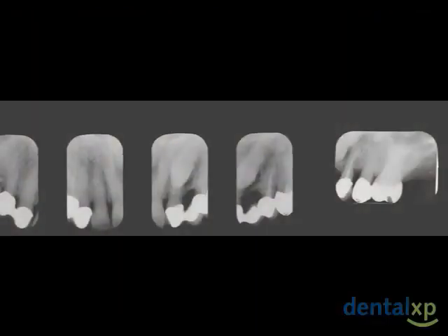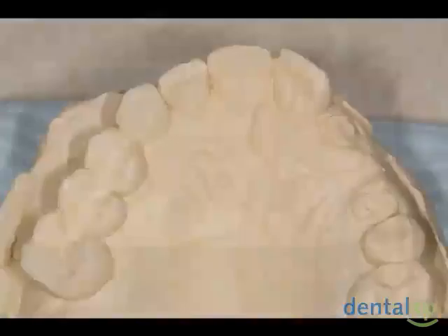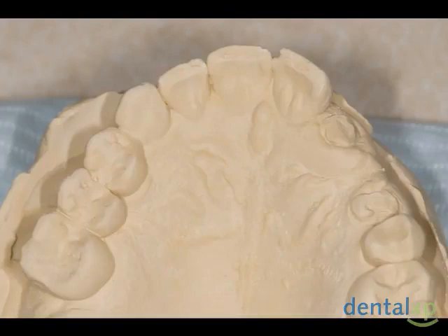Radiographs of the bridge prior to breakage. A CAT scan was taken to determine the location of the cuspid and whether there was enough room for implant crowns. A pan was taken. Notice the impacted cuspid and the broken bicuspid. A study model shows the fractured bridge.